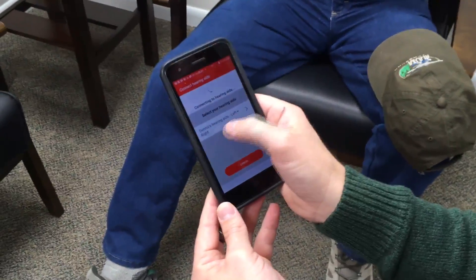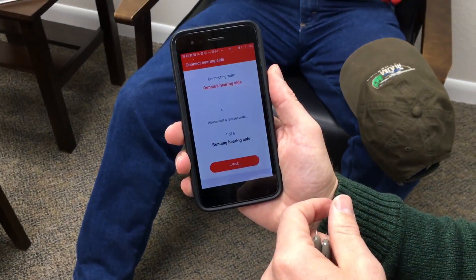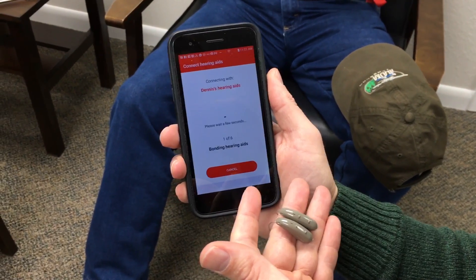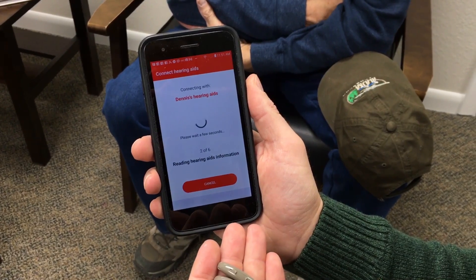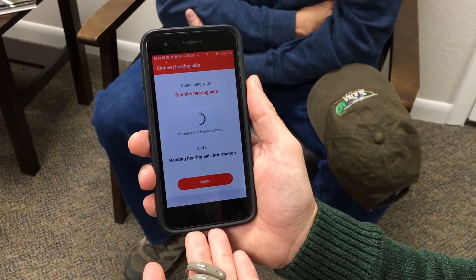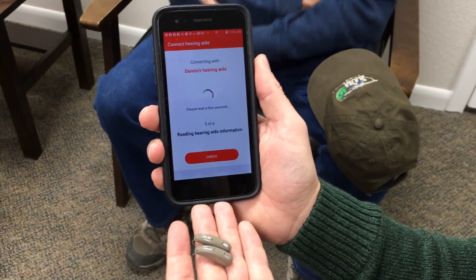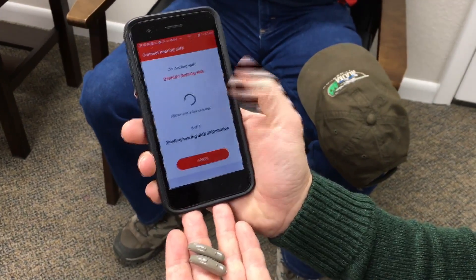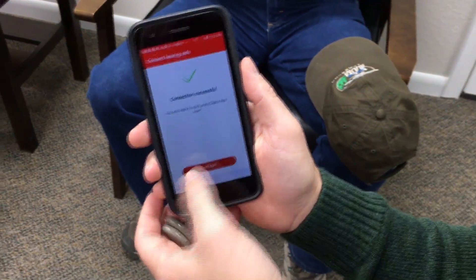It's found the left one and the right one. I'm going to hit go — it'll go through a few steps. Bonding the hearing aids is where it actually pairs with them, and then it will read out all the different information and settings on the hearing aids. Keep your hearing aids close to the phone while it does this so there's no interference. You can see it's on step six of six, and then it's ready to go.